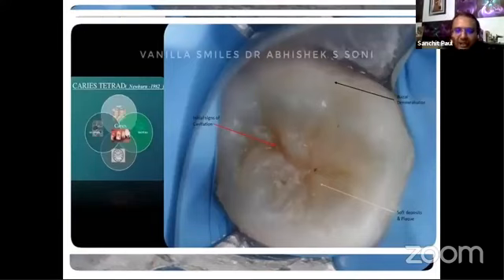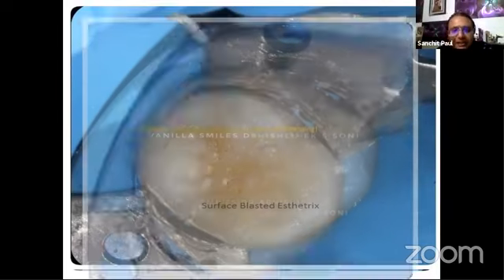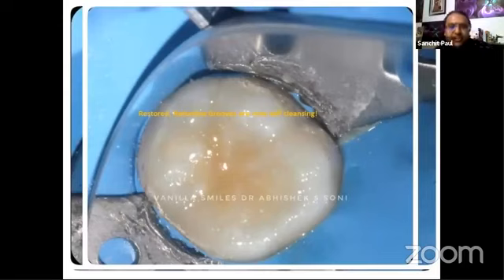and only once we clean that whole occlusal surface can we make out the initial signs of cavitation or demineralization. This is very, very important because unless we clean the surface, no matter what sealant we are using, it's going to fail eventually, because there's a biofilm adhering to the grooves which is going to fail the bonding of the sealant to that groove. Only once we use a good prophy pumice or a surface blasted, can we see these small initial lesions, which can be managed by a combination of restoration and sealant, as we mentioned. And most importantly, they are self-cleansing.